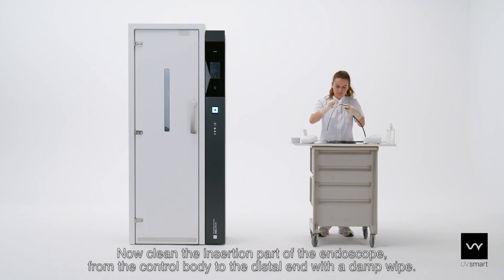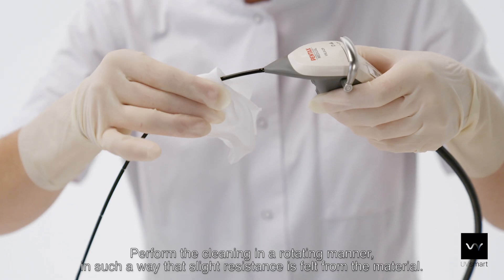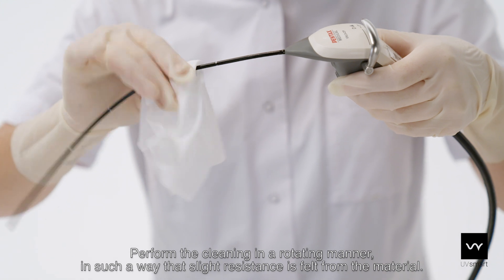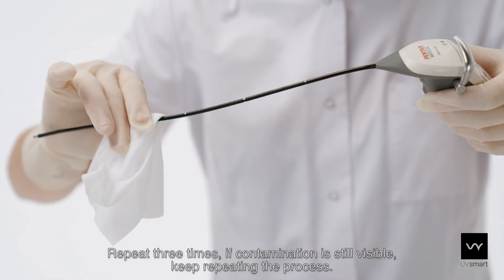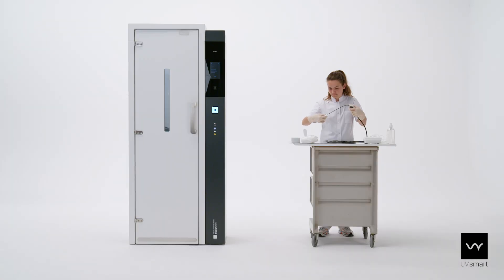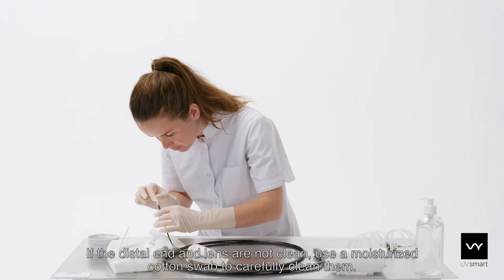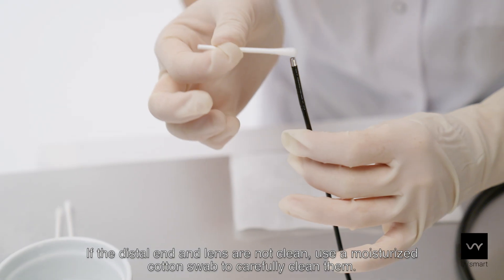Now clean the insertion part of the endoscope from the control body to the distal end with a damp wipe. Perform the cleaning in a rotating manner such that slight resistance is felt from the material. Repeat three times. If contamination is still visible, keep repeating the process. If the distal end and lens are not clean, use a moisturized cotton swab to carefully clean them.